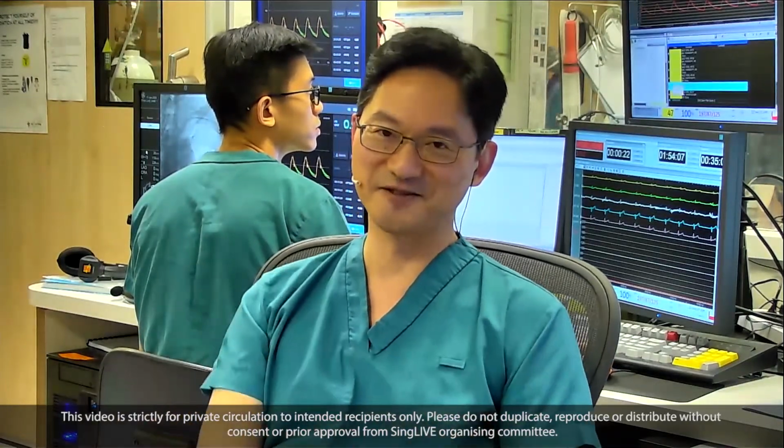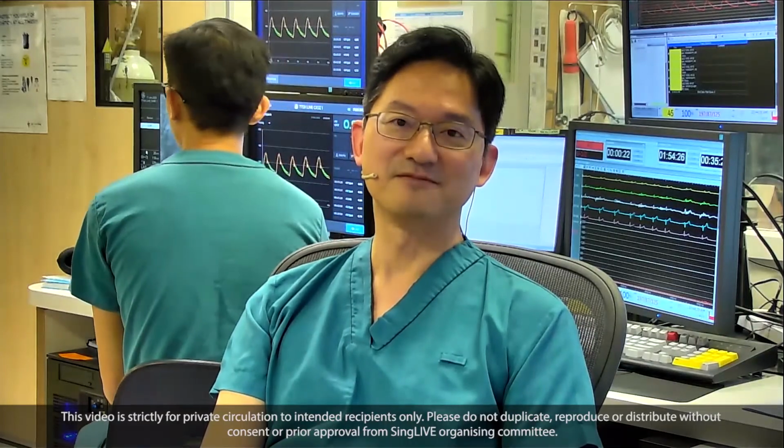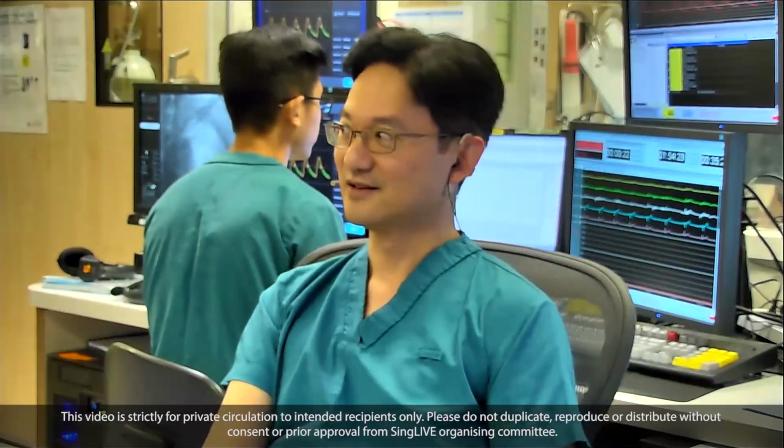So the other advantage I can see, Paul, is you're using the left radial. I don't think many of us will use the left radial approach. It's actually more comfortable for the patients when they get off the table with just a left radial wound, so that they can use their right hand and start off their life again. So with that, thank you, Paul. It's an elegant case, very nicely done.